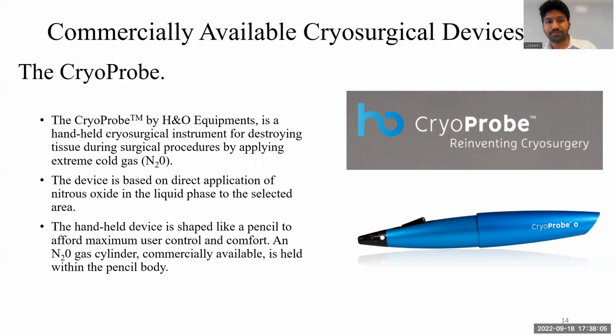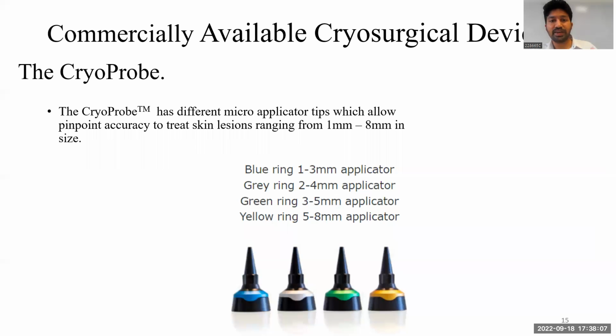And then we have different micro applicators, which we have shown here, ranging from 1 millimeter to 8 millimeter. Based on the type of lesion we are trying to treat, we can use certain types of cryoprobes, ranging from 1 millimeter to 8 millimeter accuracy.